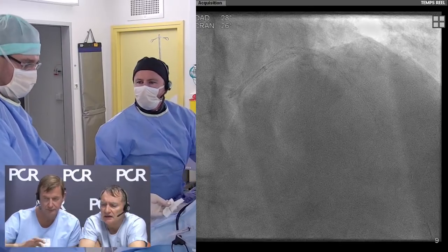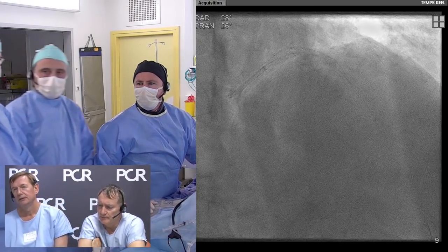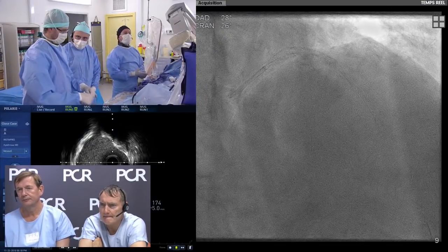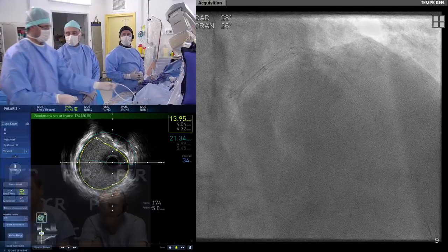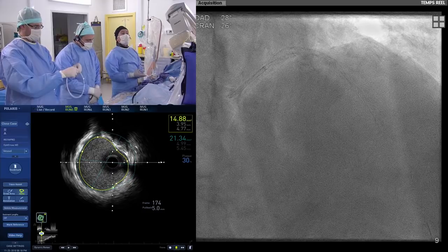Tu peux mettre en milieu là, le tronc il fait combien? 5,5 ou pas? Avant. Sorry. So there's a question about pharmacology. Okay, a balloon 5.5, it will be better. A balloon 5.5. We follow you, Adam.